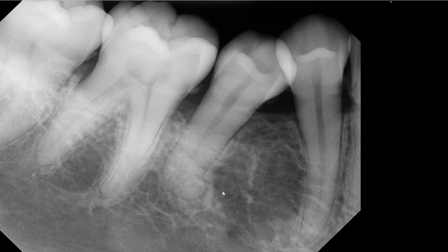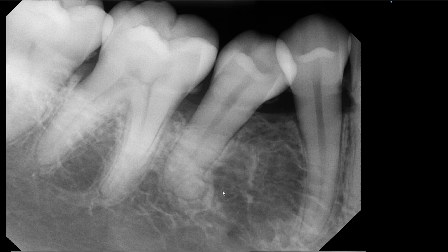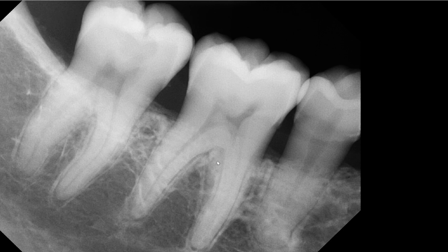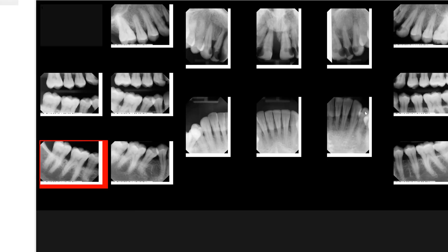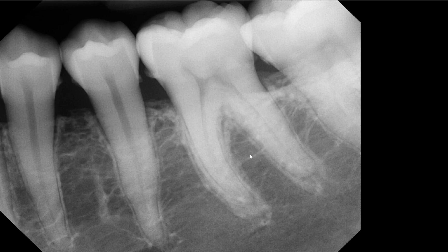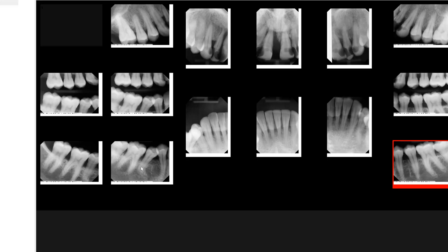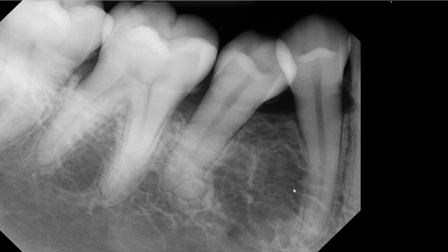Let's go back to the posterior PA of that area — that's kind of what you see. Let's go ahead and compare with the contralateral side. This is the posterior premolar PA of the other side: tooth numbers 19, 20, and 21. Compare the interdental distance between these two versus this one.